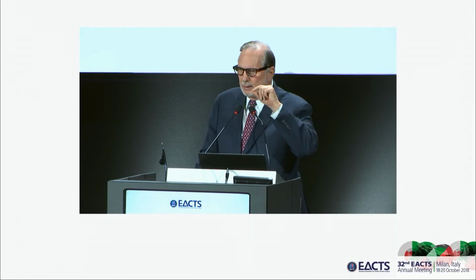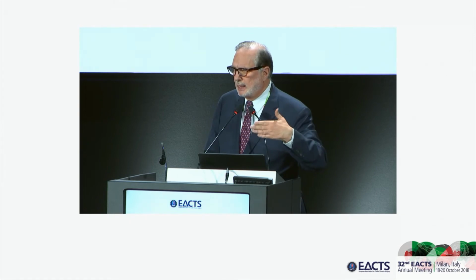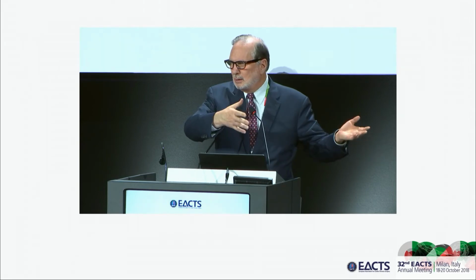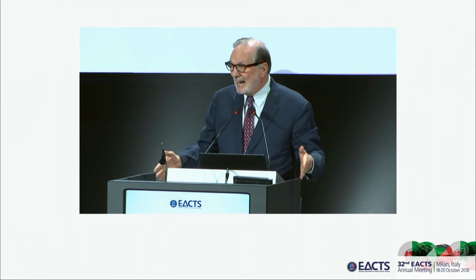The only one that might have worked regarding no residual AI, in other words, just leave the damn thing alone, was the 5th case where there was no AI to begin with. But most of these cases had +2 to +3 AI, and so we really wanted to make that 0. But I just felt like I couldn't. So you're in that zone between doing nothing, but realizing that the patient's aortic valve was not the reason why they were in the operating room.